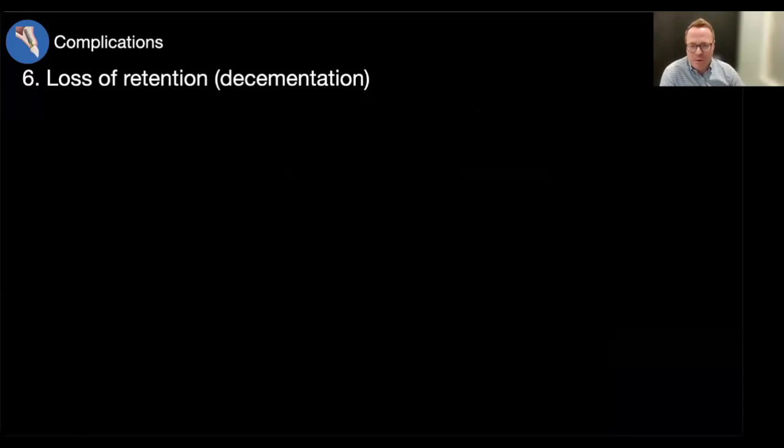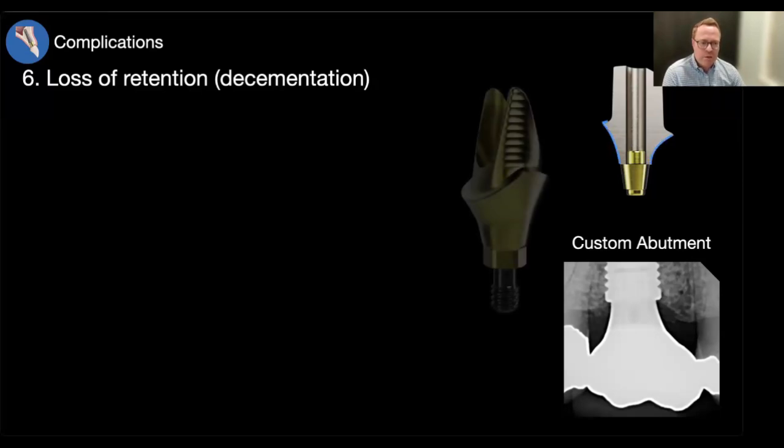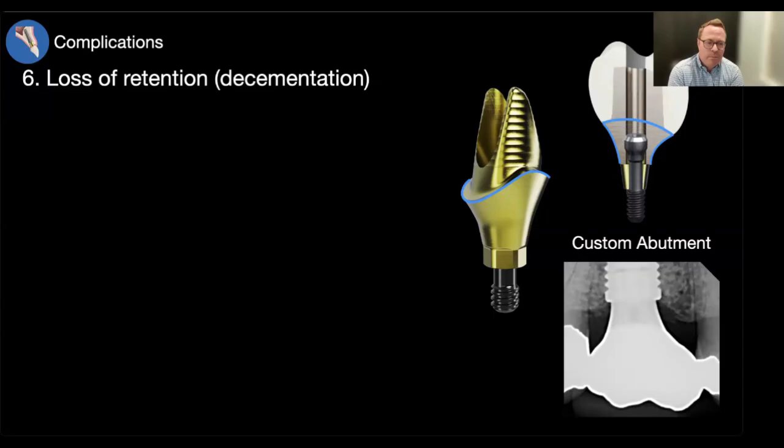The other factor that we want to think about is we can do other things to avoid cementing in the mouth. And that's where we can do custom abutments, and then we can do screw-mentable crowns. So we still cement a crown, but it has a screw access hole, which allows us to remove the crown and clean the excess cement and make it retrievable. And so that to me is kind of the best of both worlds.